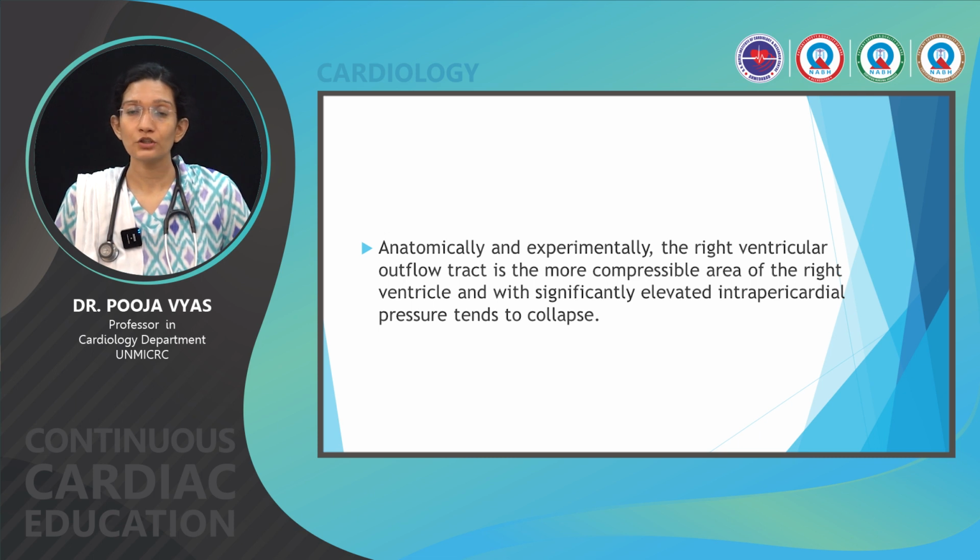Also, anatomically and experimentally, the right ventricular outflow tract is the most compressible area of the right ventricle, and so with significantly elevated intrapericardial pressure, it tends to collapse.